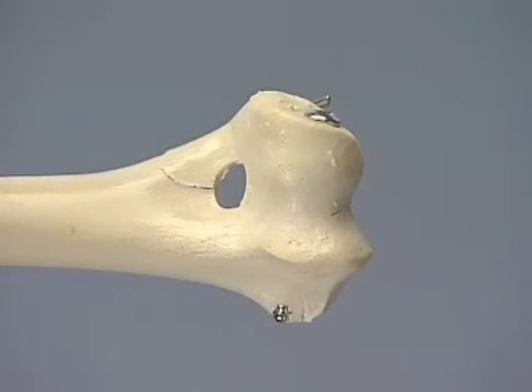When the bone is soft, as it might be in a young animal, the countersink is not used. In this case, a washer is used with the screw to keep the screw head from pulling through the bone as the screw is tightened. The critical part of the repair is restoring the articular congruency utilizing interfragmentary compression.